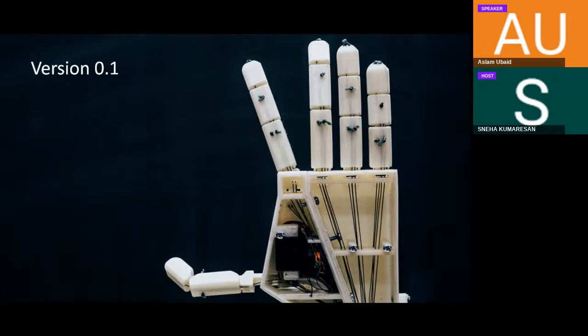So we came up with a different design, which needed BLDC motors on each joint. But the problem which we faced then was that such a small motor with the high torque that we required was not available. So we tried to do with what normal robotic arms, the arms that we see in an automobile manufacturing company, etc., would do, and we tried to augment it. And to my surprise, it didn't work as well.